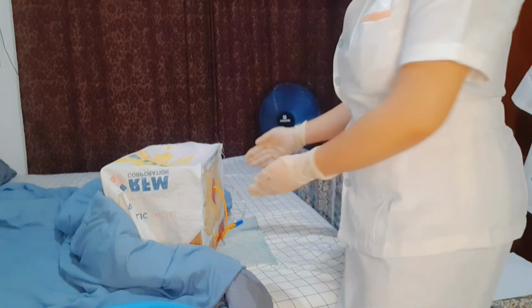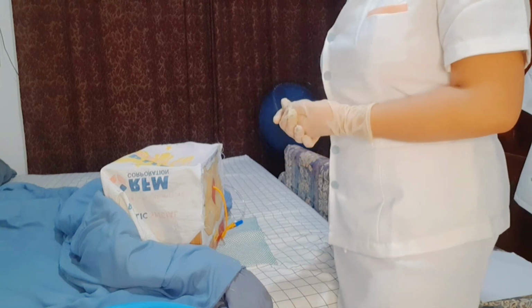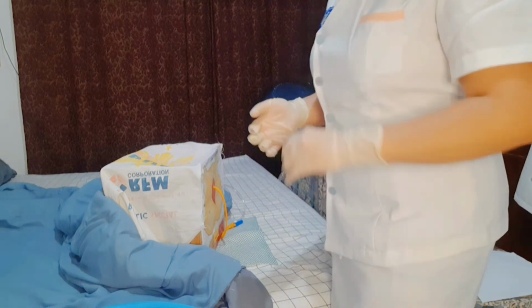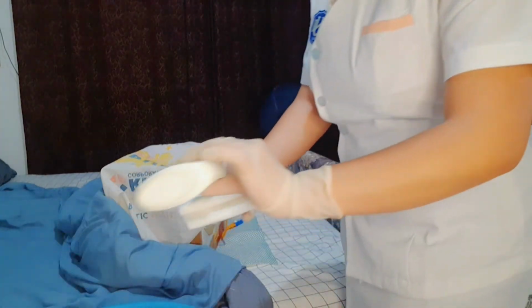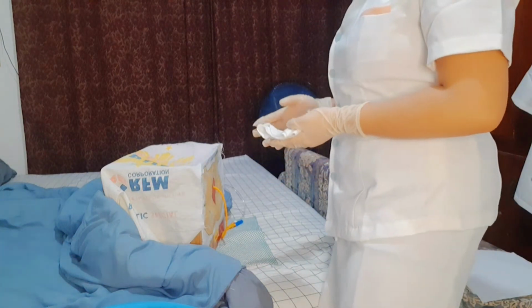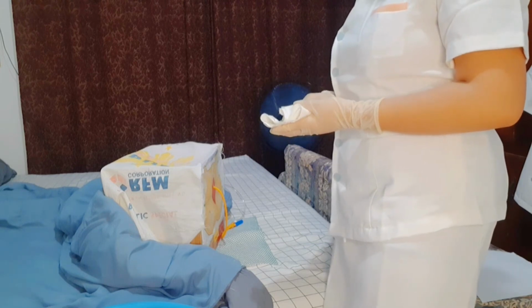So of course, after cleansing the labia, the next thing you will do is cleanse the catheter. You need to hold the catheter tubing, taking care not to pull on the catheter. Begin at the meatus and cleanse toward the end of the catheter. So, of course, I have the cloth again here. Put some water, put some soap. Cleaning from most to least clean decreases the risk of urinary tract infections or UTI. Trauma to the urethra and bladder is decreased when the catheter tubing is not pulled.